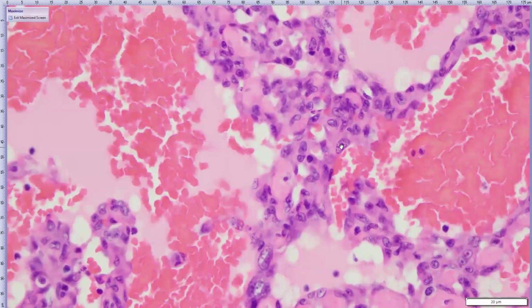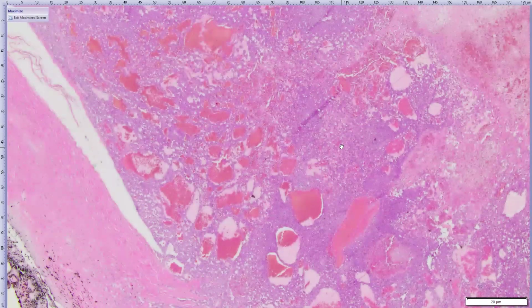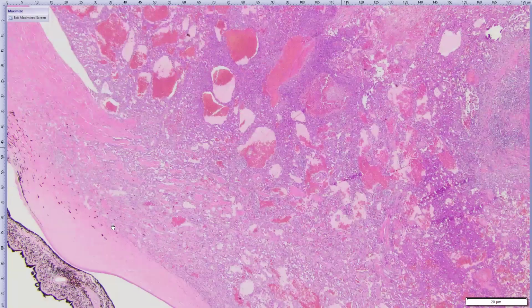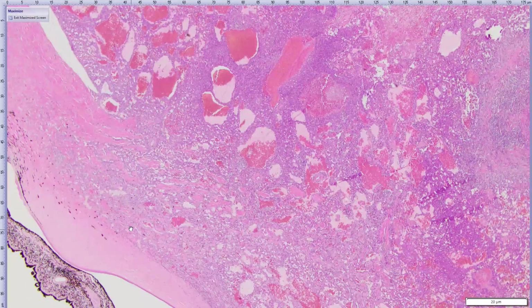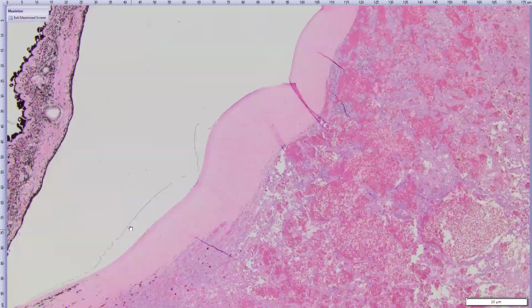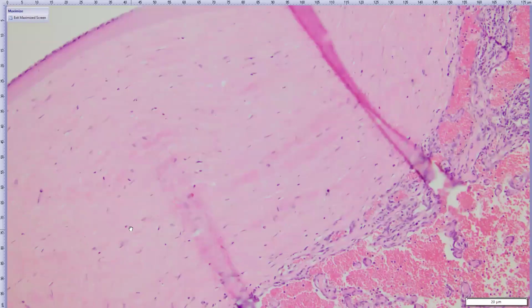This tumor, if you haven't already guessed, is a hemangiosarcoma. So we've got an ocular surface or corneoconjunctival hemangiosarcoma with a bit of extension into sclera and episclera. Here it is in the sclera on this side. It's got a pretty extensively necrotic superficial aspect. And then in the deep aspect, just showing off how kind of unbothered this cornea is. It's very centered on the superficial to mid cornea in this case.